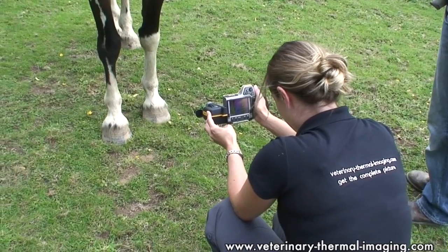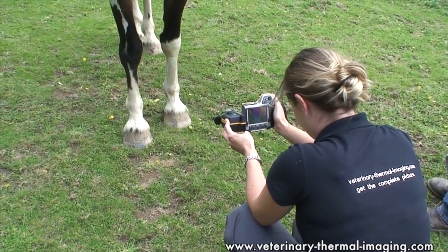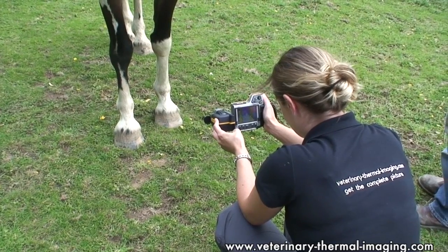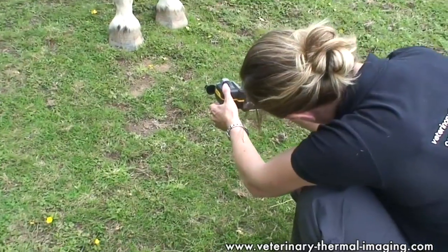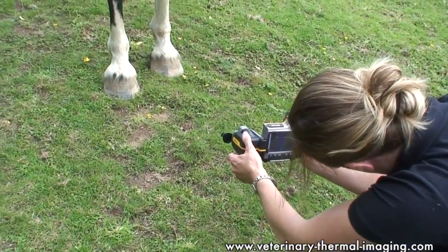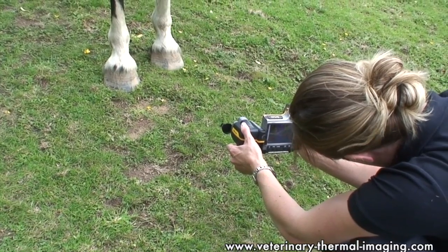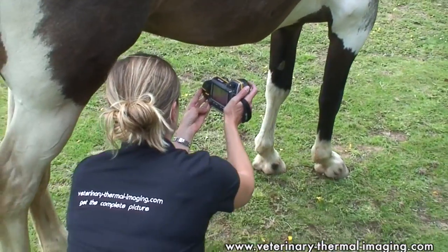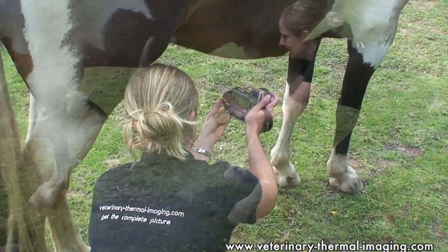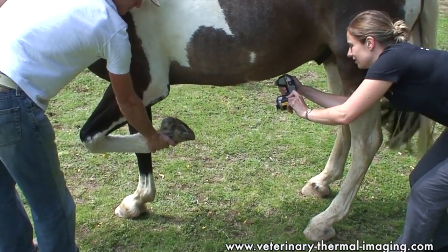Thermal imaging is a really useful tool for assessing conditions in the foot. We can look at hoof balance — where the hoof is in balance and the horse is putting more pressure through one side rather than the other. It creates friction and heat, and that's what we can pick up with the camera. It's very clear to see when a hoof is imbalanced. Other problems such as laminitis or navicular syndrome can also be picked up easily with a thermal imaging camera and monitored.